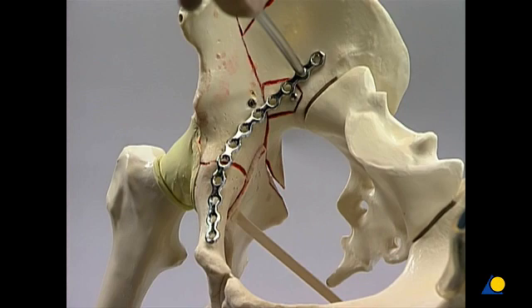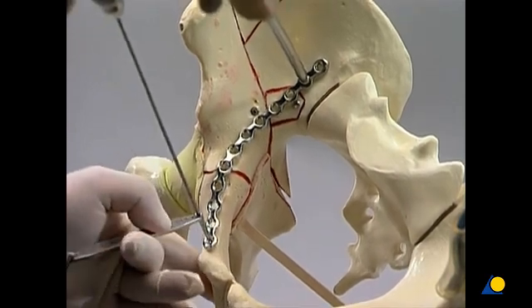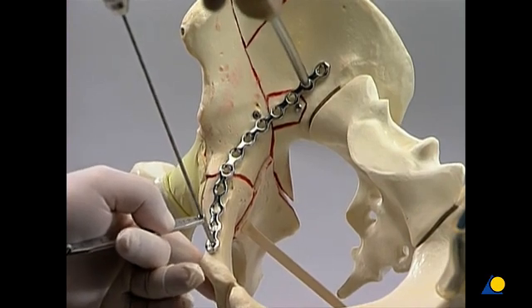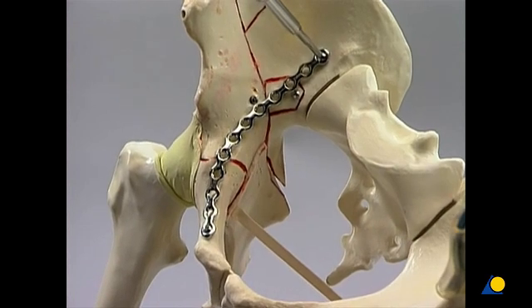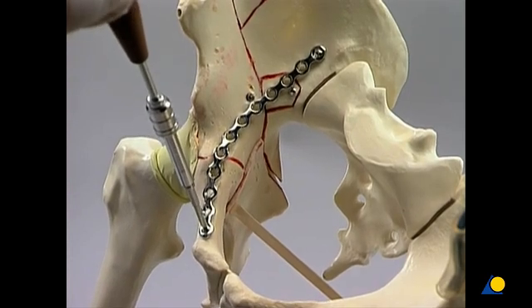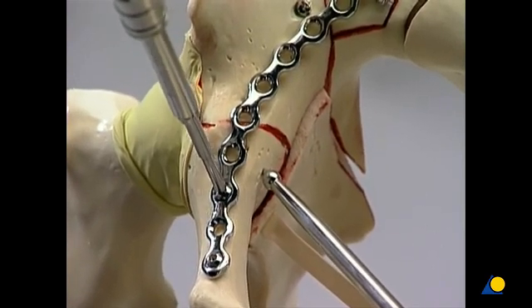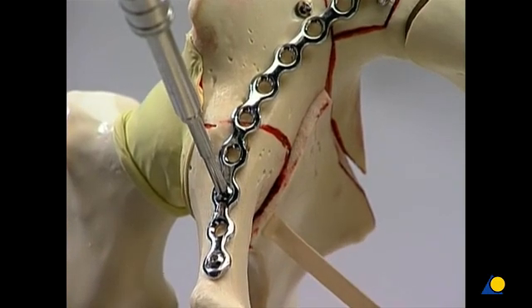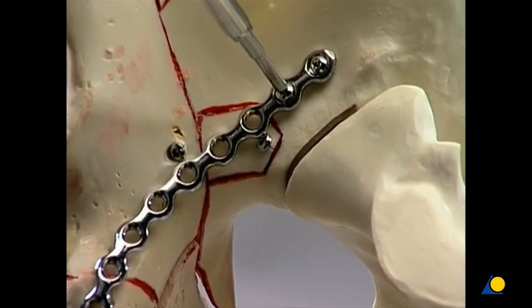The plate is laid on the pelvic brim with the proximal end held in place using the ball spike. At the distal end, the plate position is adjusted and the plate is fixed in place with a 3.5 mm screw. After adjusting the plate position in the posterior aspect of the pelvis, a 3.5 mm screw is inserted parallel to the sacroiliac joint. The distal screw is secured. The ball spike is introduced to help improve the position of the anterior column fracture components, and a screw is inserted through the third distal plate hole. A second screw is placed in the proximal end of the plate.